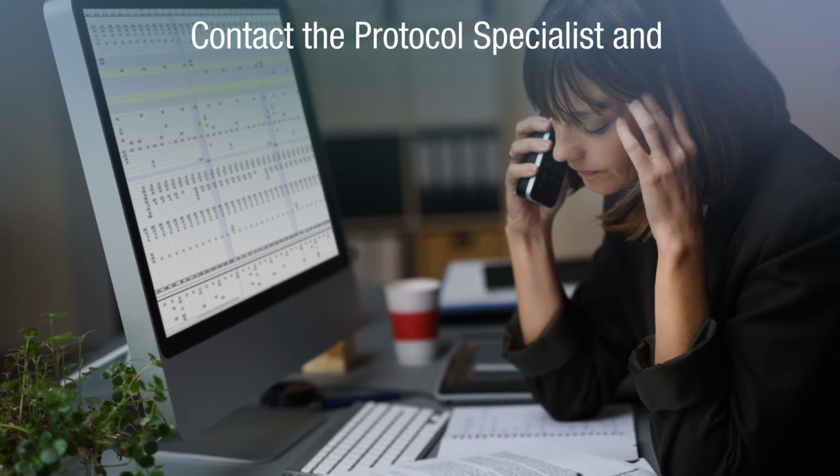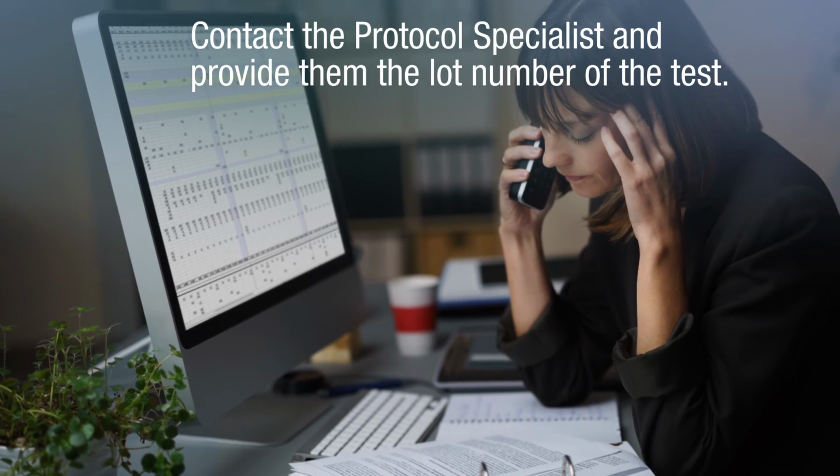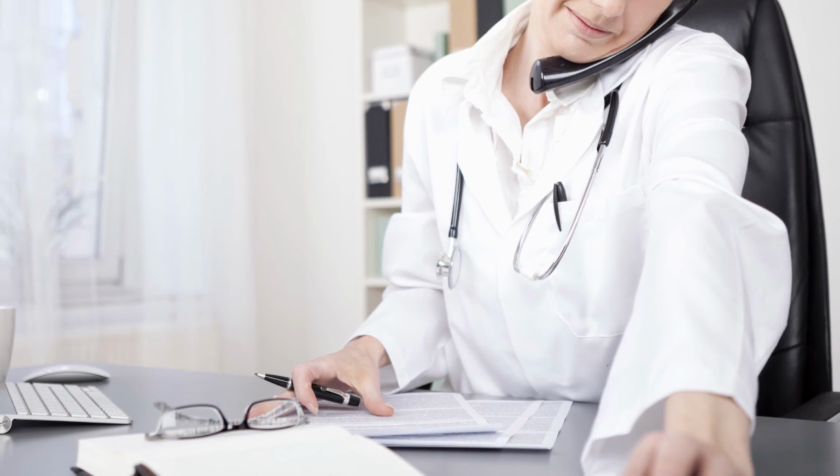What if multiple tests show as false positives or multiple tests come back invalid? Again, this is very rare, but if you notice a trend with false positives or invalid tests, immediately contact the assigned protocol specialist at the CCC and provide to them the lot numbers of the tests in question. The tests may have been stored incorrectly, or there may have been an issue with the tests themselves.